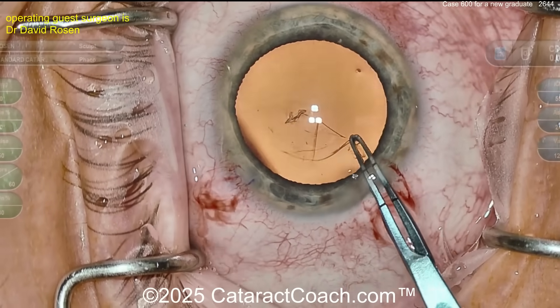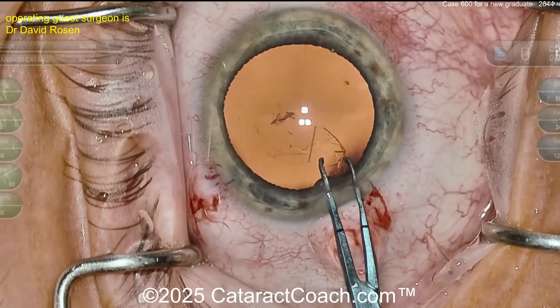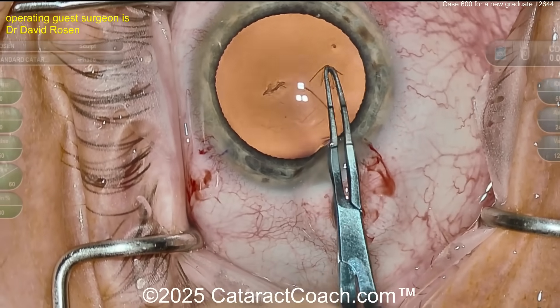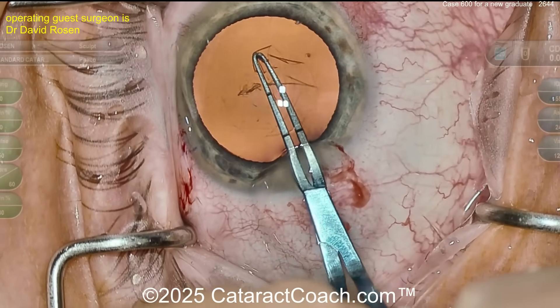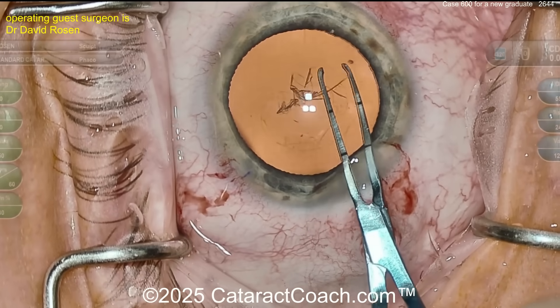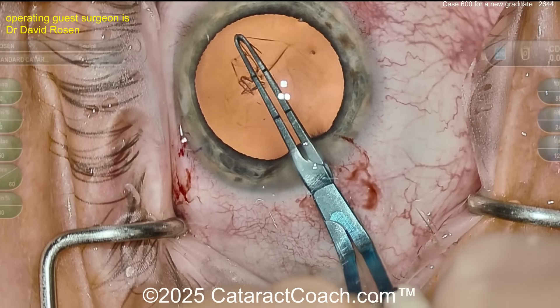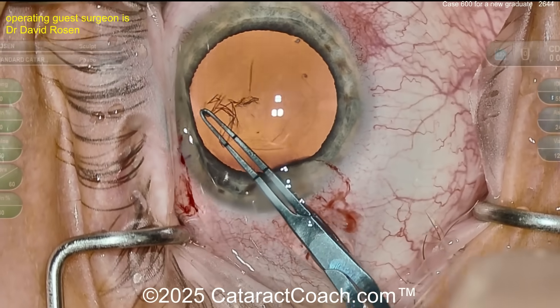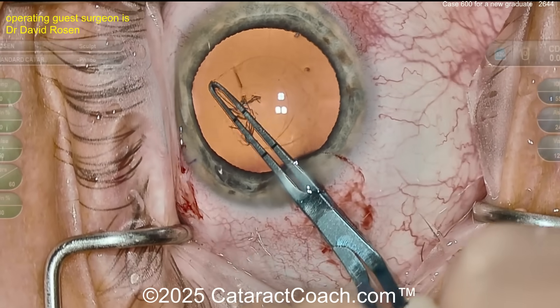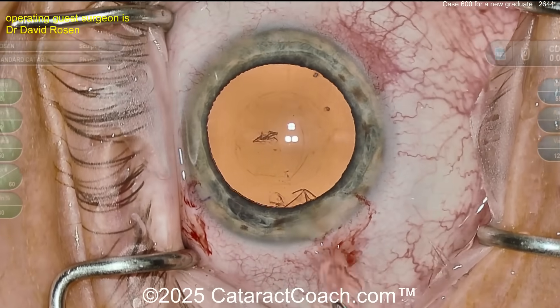Nicely done so far — I like the pivoting technique, I like how the instrument is pivoting in the incision, and that rhexis flap stays turned over. Beautiful, controlled, nice round-looking rhexis too. Continuing — very nice, looks like the video is shot in real time, which is fun. We're going to watch the whole video, not speeding it up at all; the video is about eight minutes — pretty efficient for case 600. Looks like the five millimeters desired — let's see. Bang on five millimeters. I like it, good job.